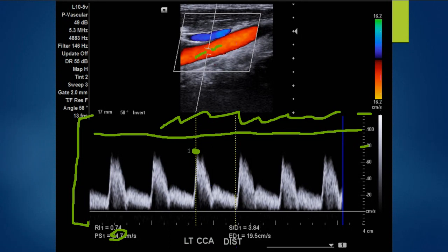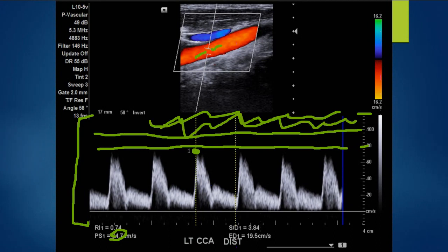It's kind of cutting it a little bit too close for us. So we want to have a little bit of room. We want to have a little bit of crust on the peanut butter and jelly sandwich, but we don't want too much where we're giving unnecessary information. Like all of this space up here is very unnecessary. We don't need that. So we could decrease our scale to an appropriate level.